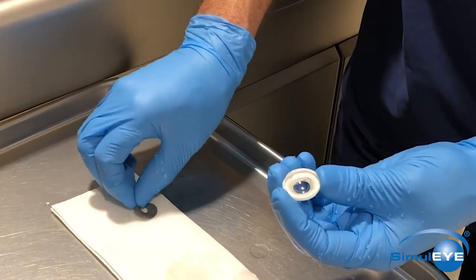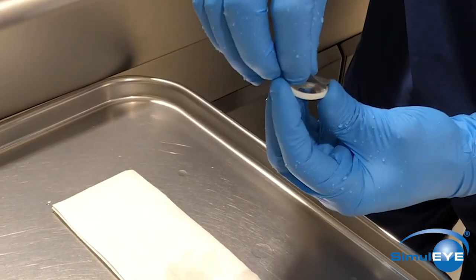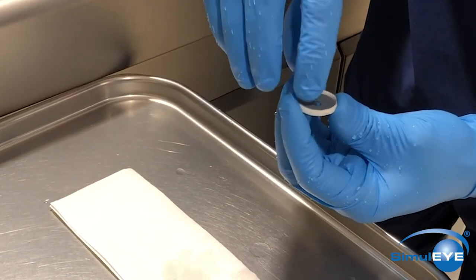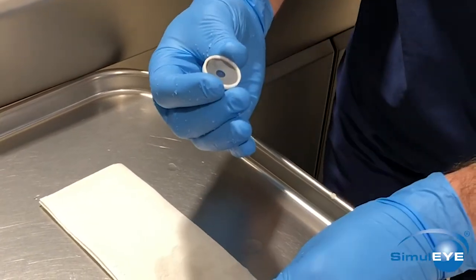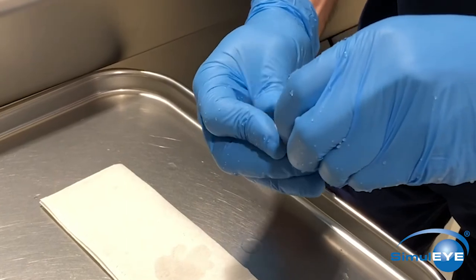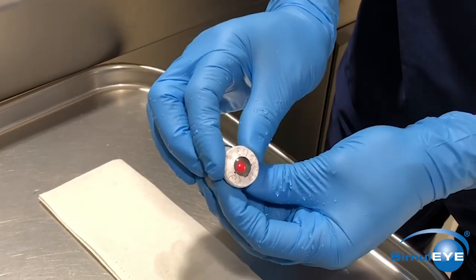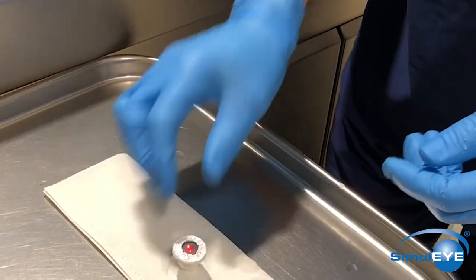To reassemble, turn the cornea cap upside down, lay the iris membrane in it, make sure it's seated well, convert the eye and reassemble it, making sure that the pupil's straight. It's ready for use again.